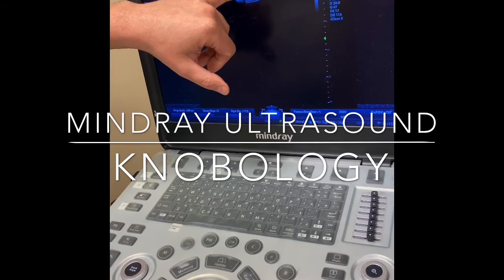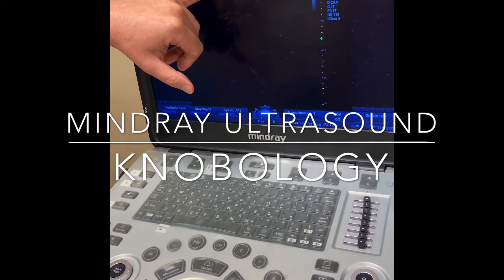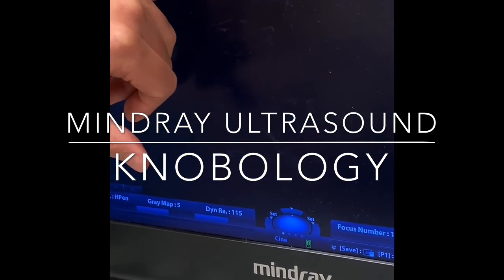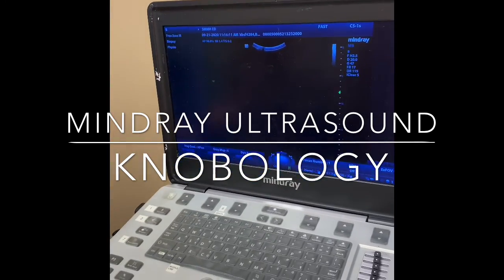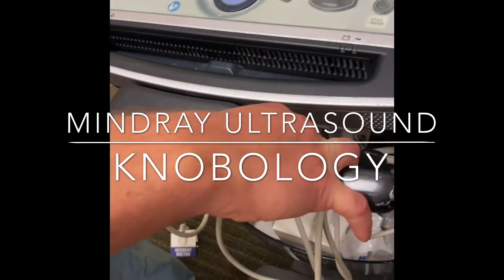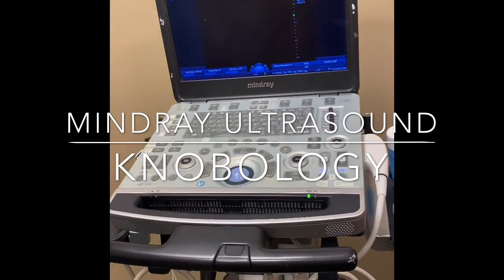You can also see that the patient's CSN and operator names populate up here. If there's only an attending, the diagnostician will not populate here, so don't be scared if you don't see it. Once you're ready to scan, one other thing you can do is use the button in front here to raise and lower the height of the machine so that you're comfortable.